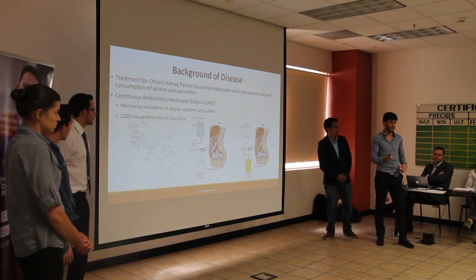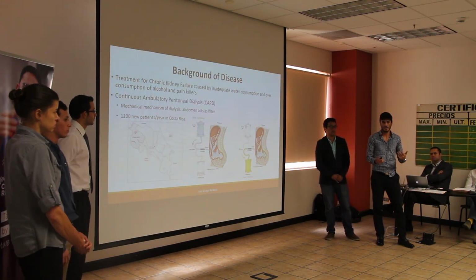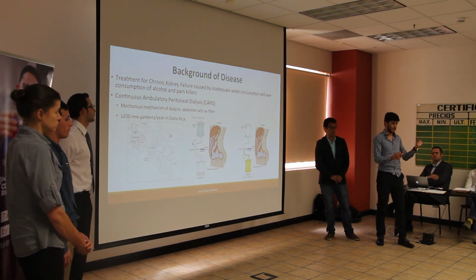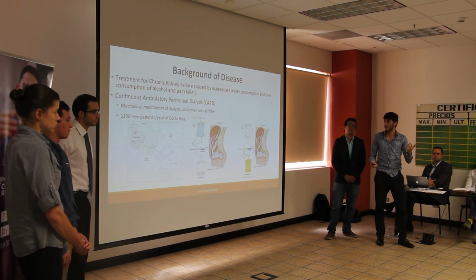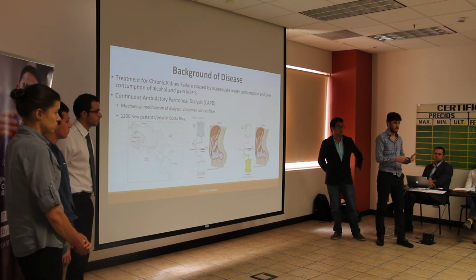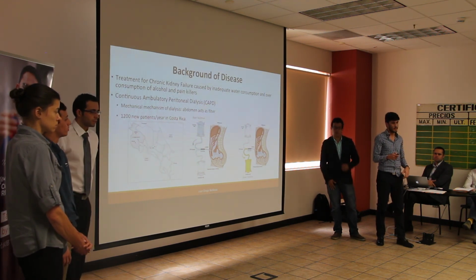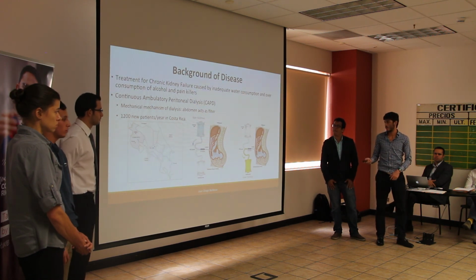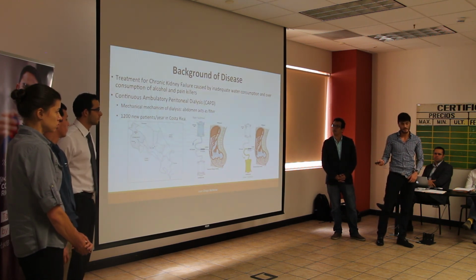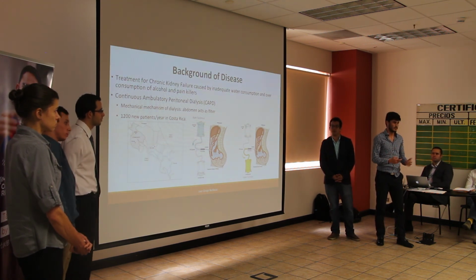Some of them had to hang the upper fluid bag from the ceiling, but some people in Liberia don't even have a ceiling to hang it from. So we worked on designing basically a stand or a home station so that they can hang both bags, including a fish scale to measure the weight of the waste bag, and considering a very, very low cost.